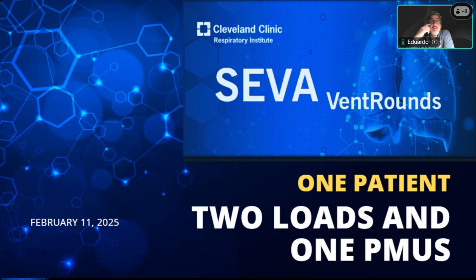And today we'll use a case that Ariel Garnero sent a while ago, but as I was preparing, I found that I thought this was great. It's a case of one patient, 2 loads, and 1 PMUS.